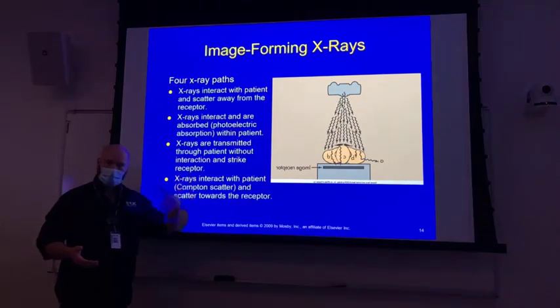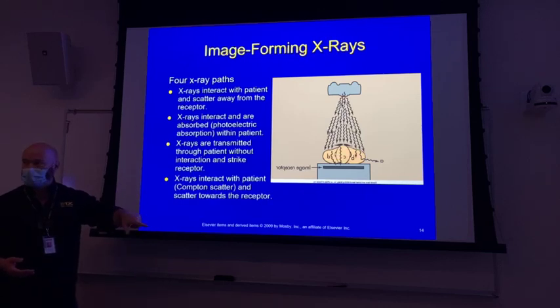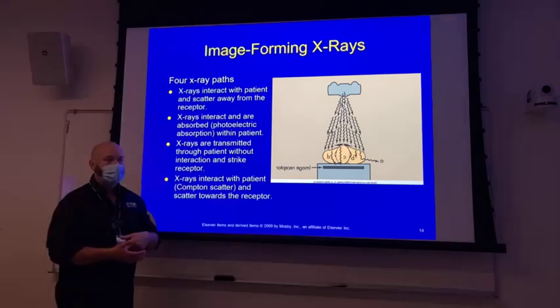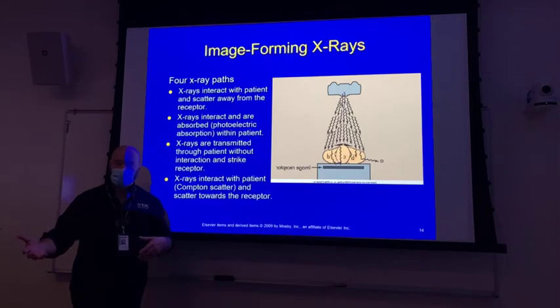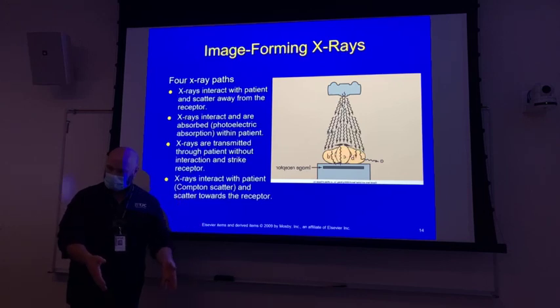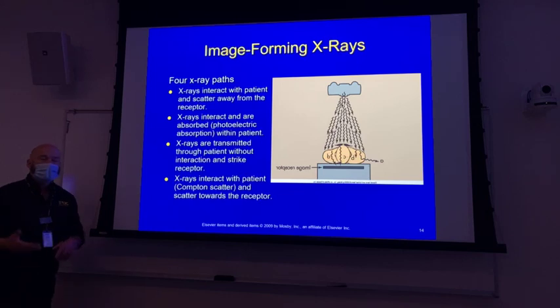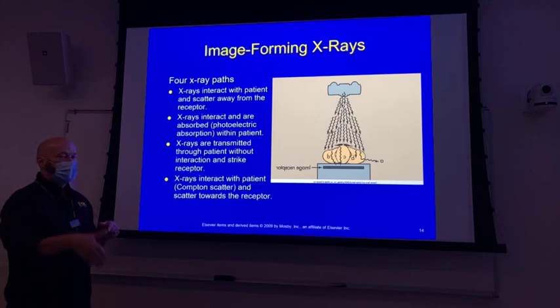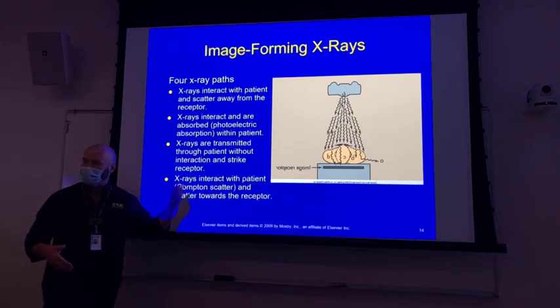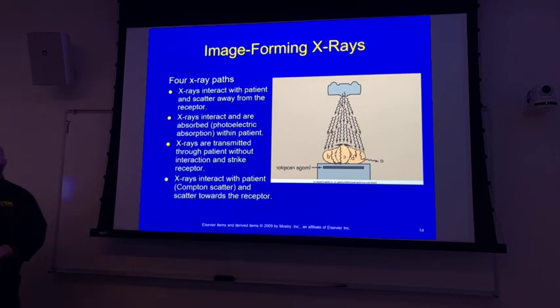Because you can undergo a number of these ionizing events, and that one scattered X-ray photon may exit the patient and hit the image receptor, but all those atoms that it ionized on its way through can also emit X-rays that also hit the image receptor, okay? So high kVp is not just the single photon with the high kVp that strikes the image receptor, but it's creating X-rays inside of the patient that also exit the patient and create fog as well, okay?